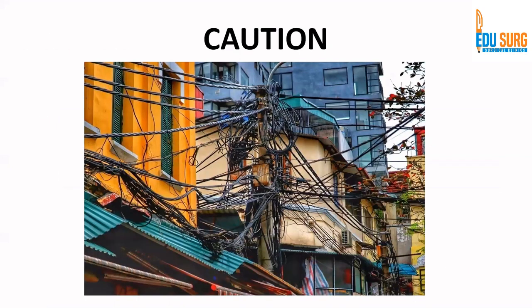So now coming to some technical points before ending this video. A very important point for all surgeons to understand is that your table should not look like this, right? You can't have wires that are completely jumbled up. In current surgery, a lot of technical devices are used. We will see some of them in upcoming videos in this energy sources series.